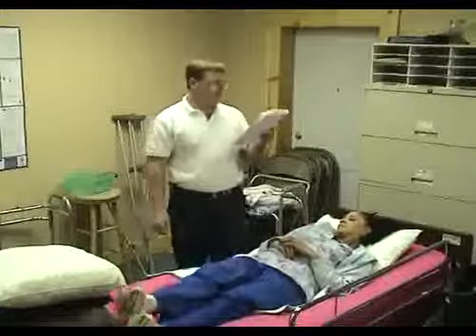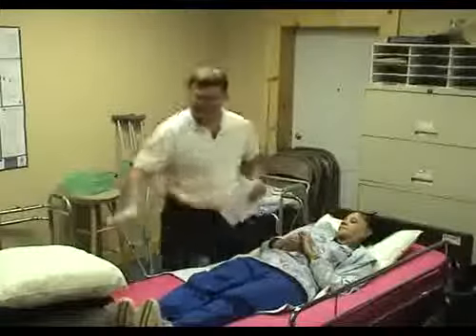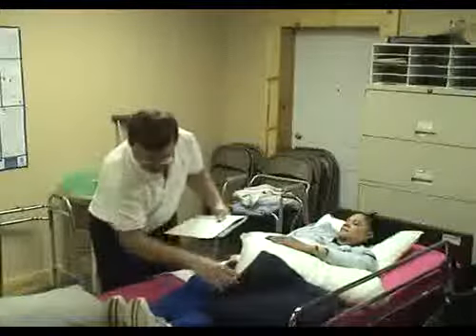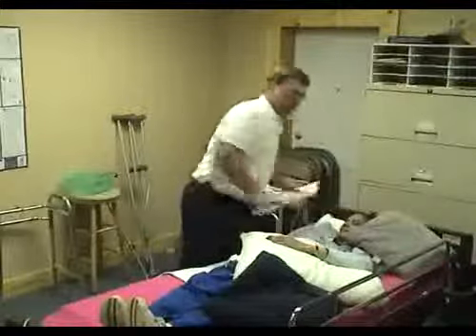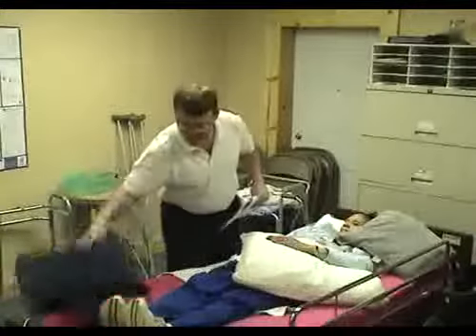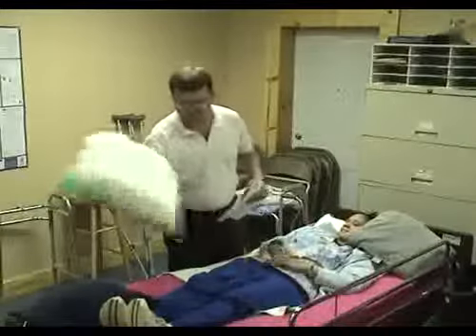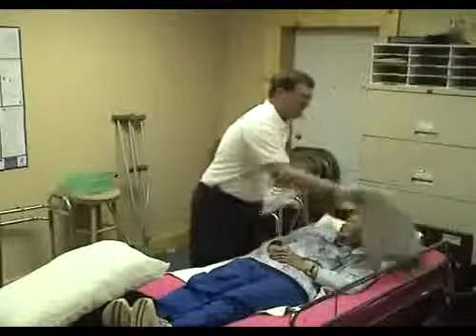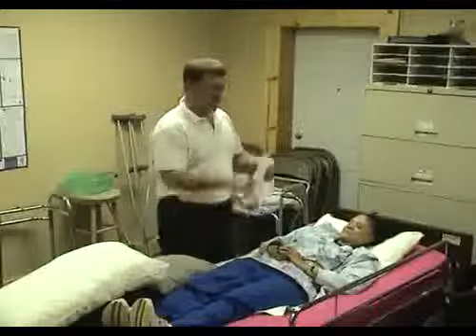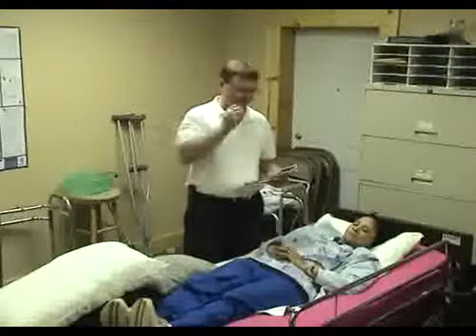Okay, removes all pillows and bed covers that might restrict movement. If I had pillows over here underneath of this arm, and I had pillows over here, and a pillow up there, how am I going to roll her that way when everything's in the way? Plain and simple. Unless I roll her on top of all of them. Just get them out of the way before you turn them. That way there's nothing restricting you. Please watch their face whenever you're going that direction on the side rail. You don't want to bounce it off of them.